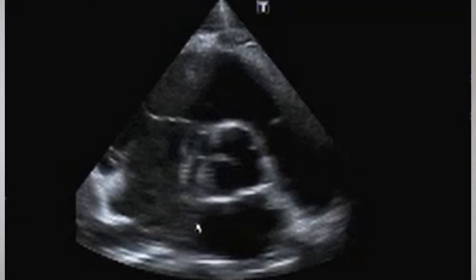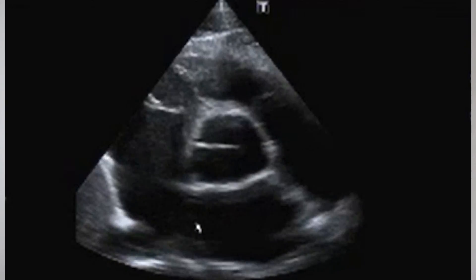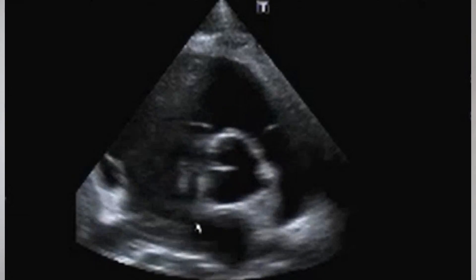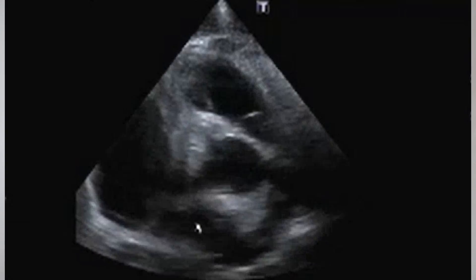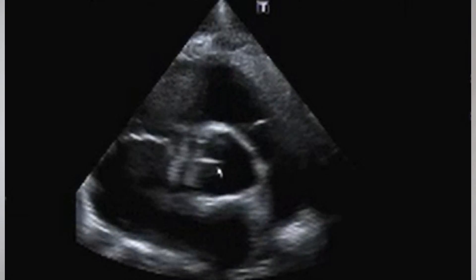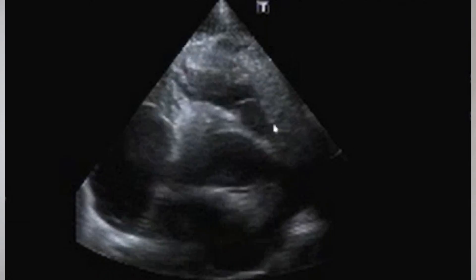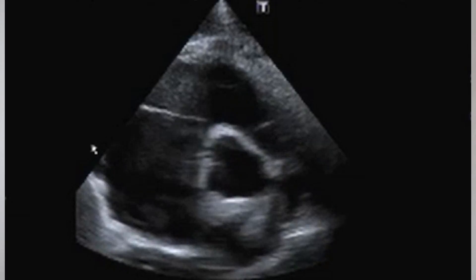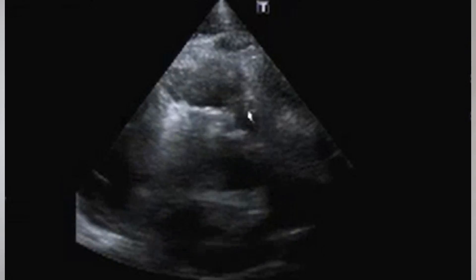I then rotate my transducer 90 degrees to get what we call the parasternal short axis view. In the center of the screen you see the aortic valve. The normal aortic valve has three leaflets — the right cusp, the posterior cusp, and the left cusp. Just above that you see the pulmonary valve, and on the left of the screen you see the right ventricle, the tricuspid valve, and the right atrium, and above and to the right the pulmonary artery.